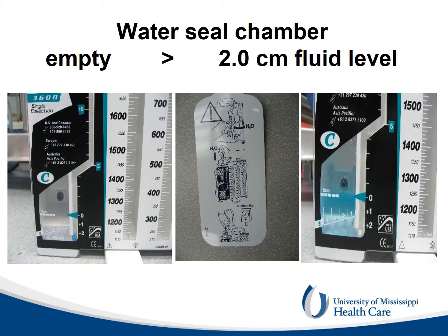The wall suction is then applied in excess of -80 millimeters of mercury from the wall suction. This suction is not directly transmitted to the chest tube and the pleura. Instead, a suction regulator in the CDU is set by the factory to -20 centimeters of water. It can be regulated from -10 to -40 centimeters of water, with this rotary dial on the left upper side of the CDU, as decided by the responsible physician.